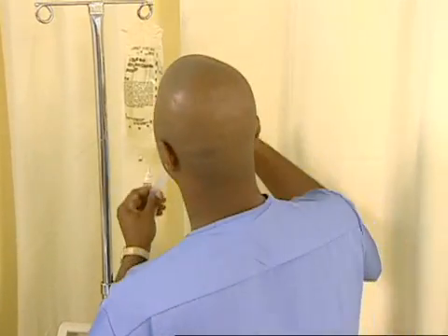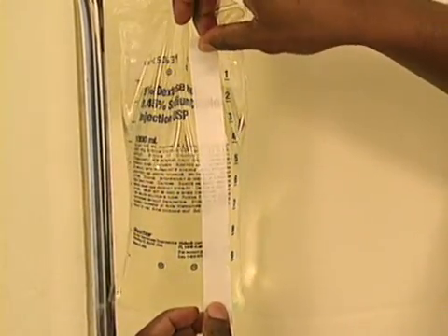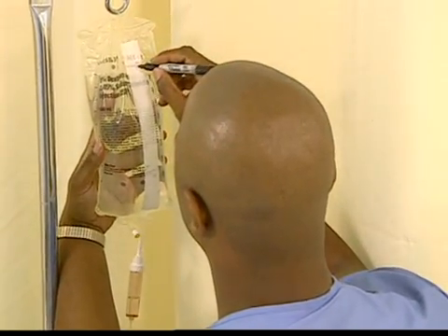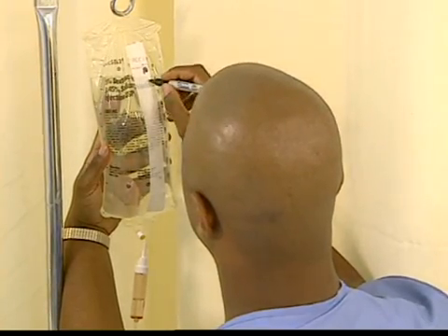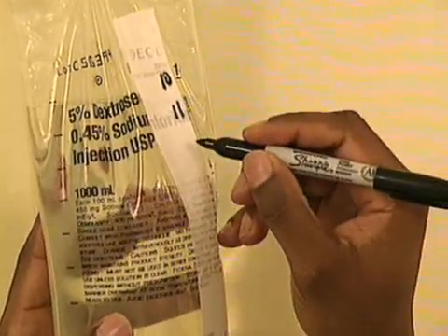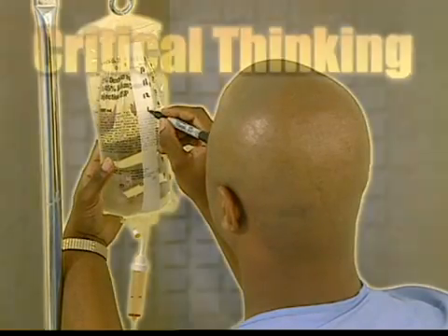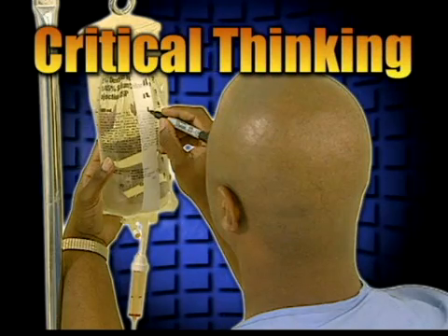Place adhesive tape or commercial fluid indicator tape on the IV bottle or bag. Next to the volume markings, mark the time intervals that correspond with the prescribed flow rate. This gives a quick visual cue for evaluating if the correct amount of fluid infuses each hour. Plan hourly assessments. If a problem develops, respond quickly to infusion pump alarms. Use your critical thinking skills as you assess the patient's IV.